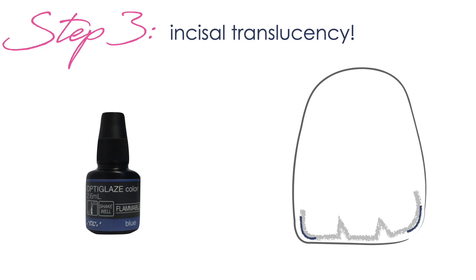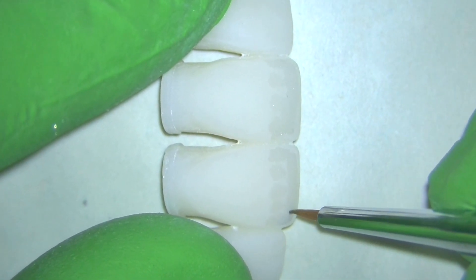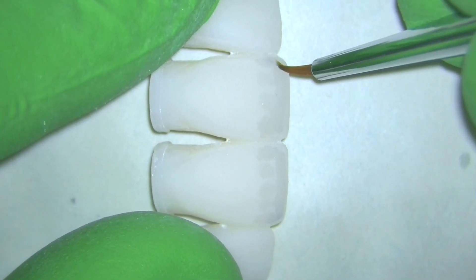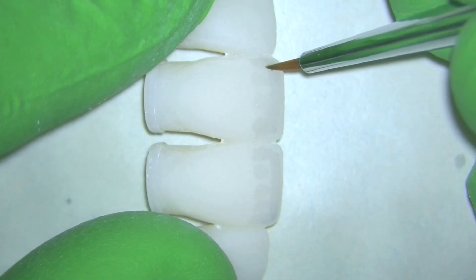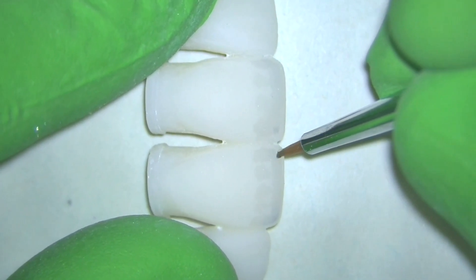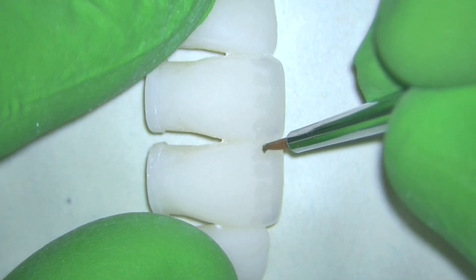Step three of the process is going to be boosting that incisal translucency a little bit out on the line angles — once again working just below the incisal edge, adding it to the corners of the tooth. Blue is really powerful, so you want this to be quite subtle when you see it on the tooth. Too much of this and it will look artificial, so I'm just adding it a little bit on those corners, then dragging it to diffuse it, and then curing with my curing light to tack that down before I add the next stain.